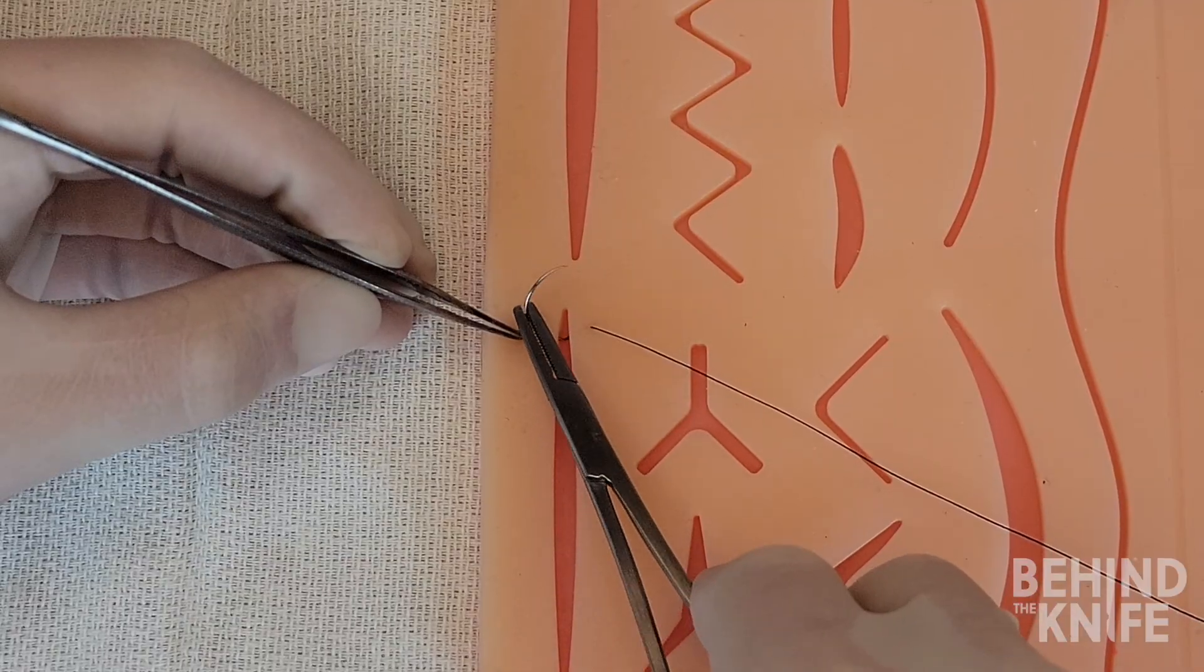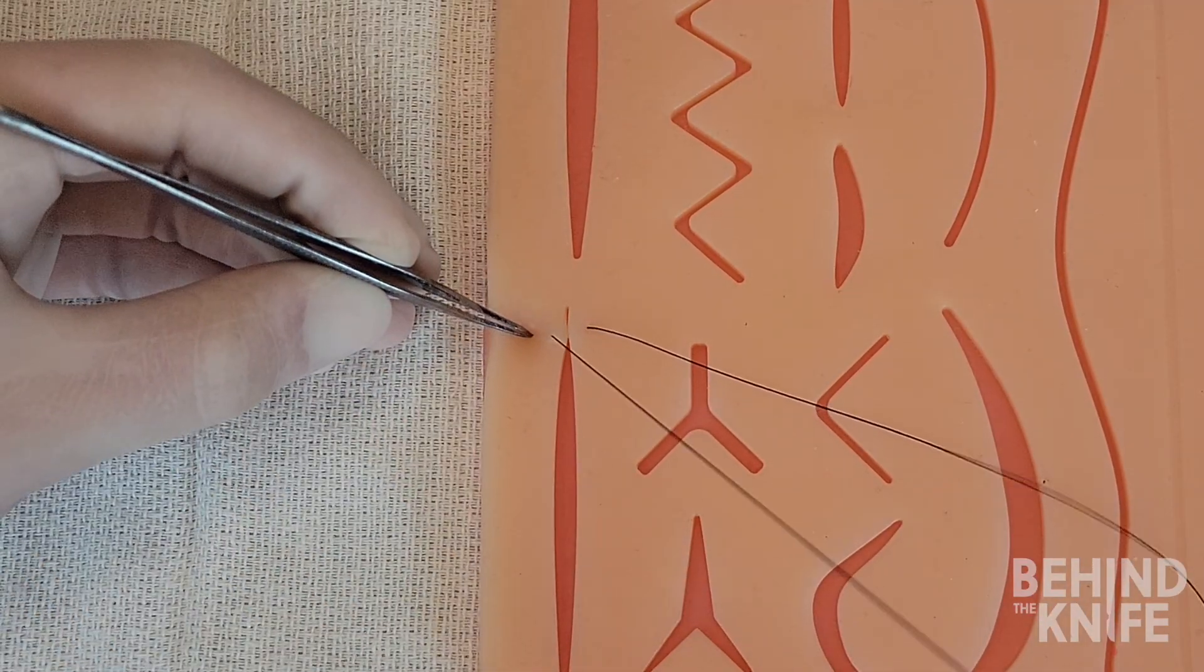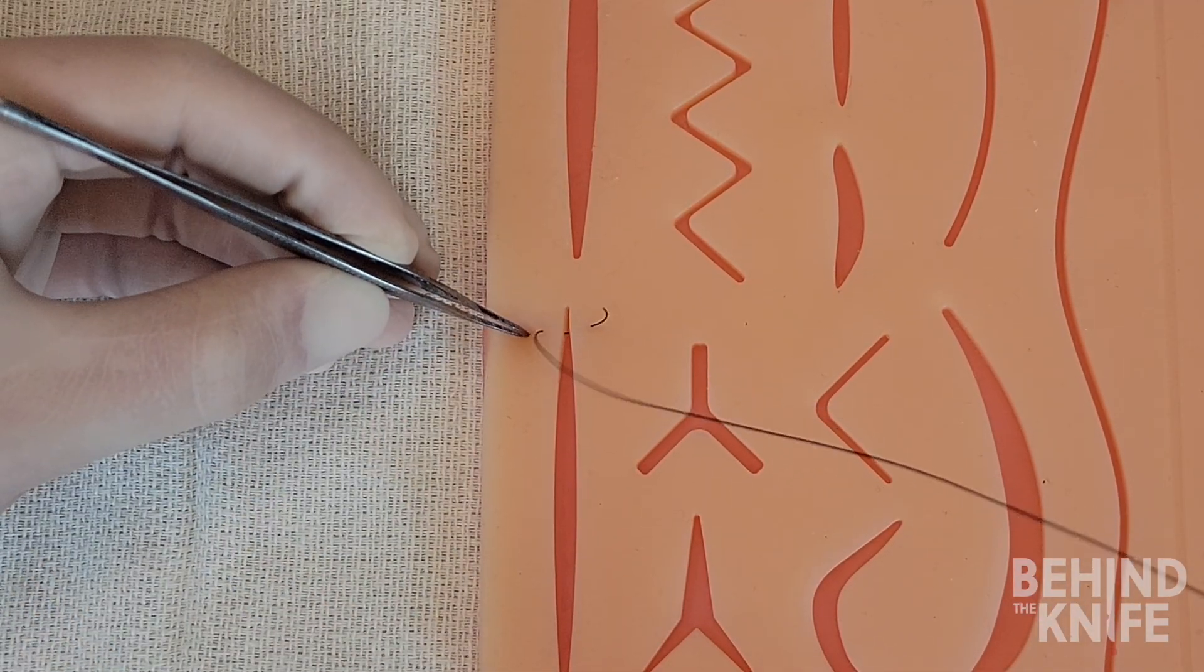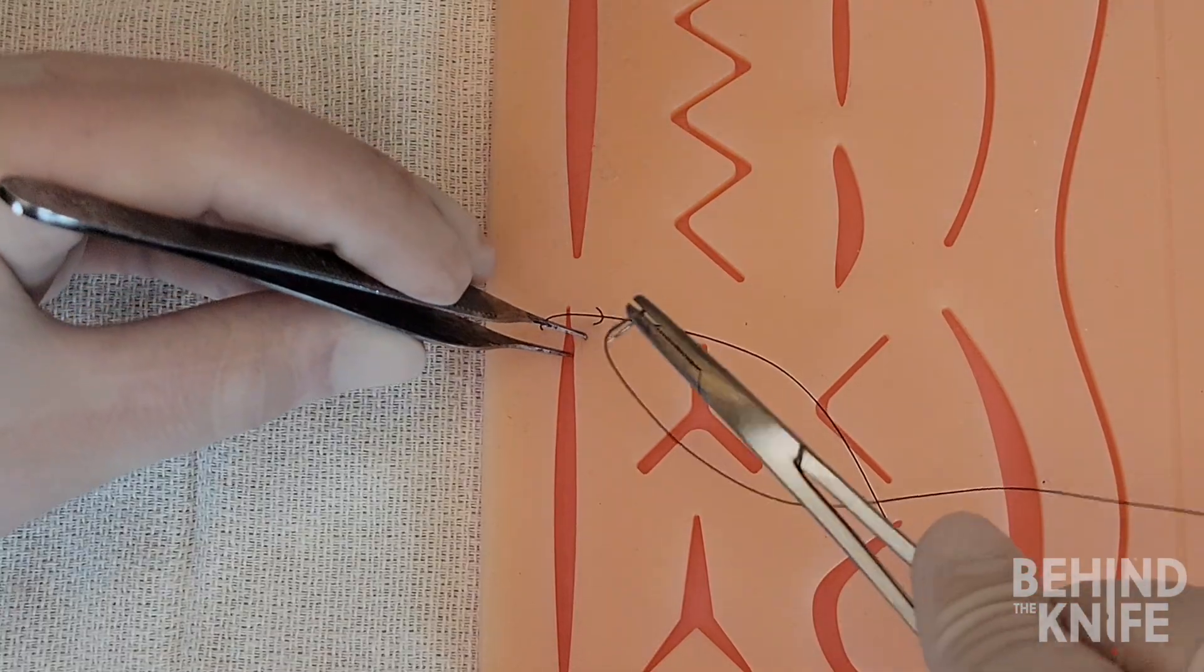Now unlike the horizontal mattress where you enter backhand at this point, we are going to come back across the wound to the side we started on and repeat the same throw.